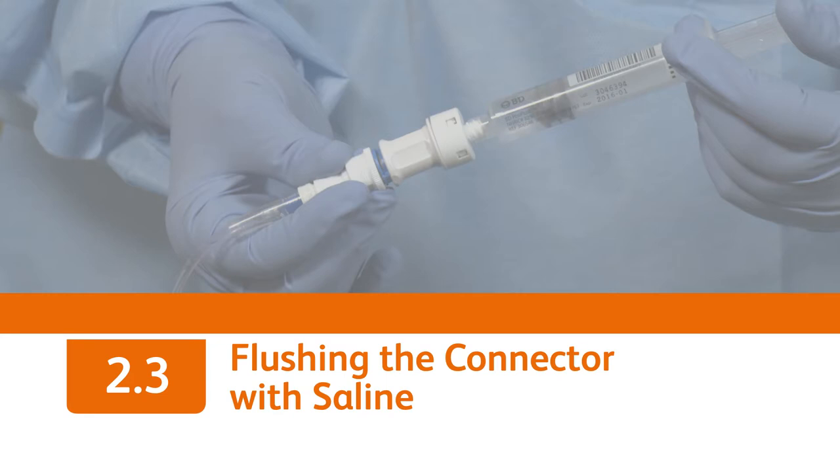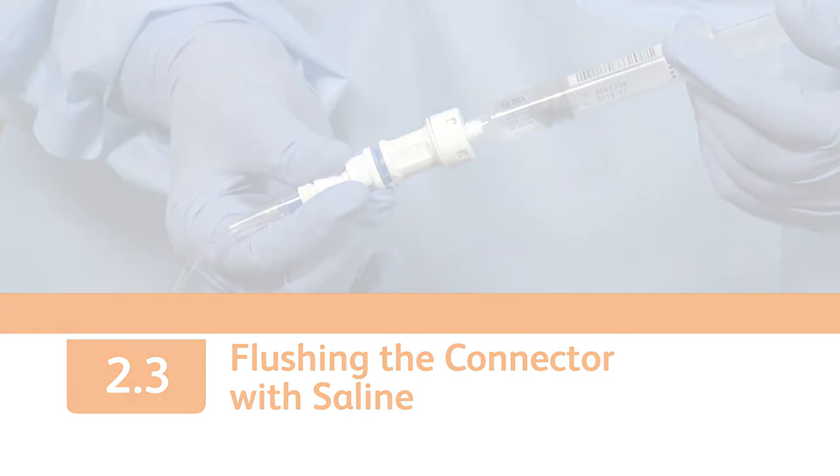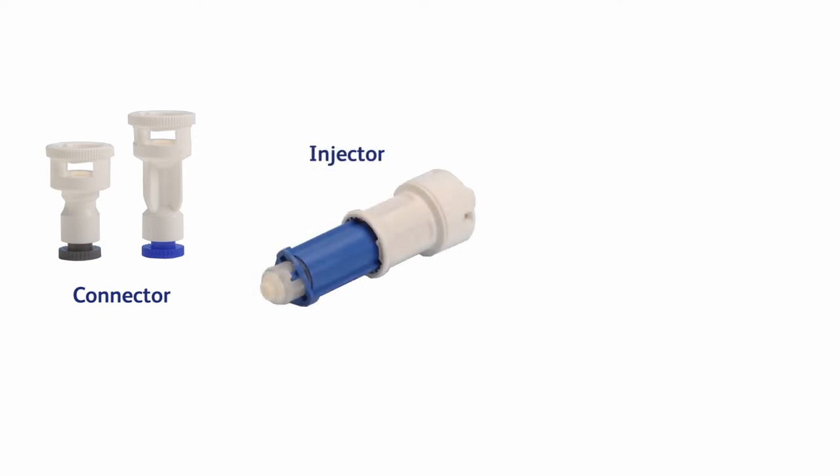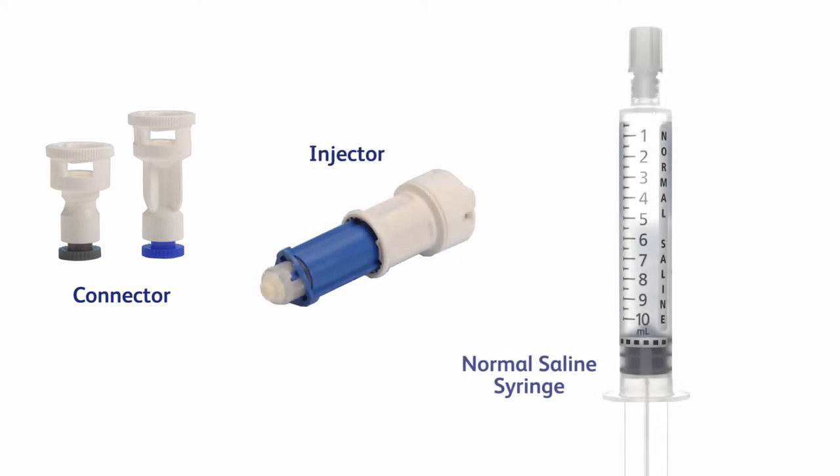Flushing a port can be easily accomplished with the BDFASIL system. You'll need a BDFASIL connector, if not already on the IV line, a BDFASIL injector, and a normal saline syringe, according to your facility's protocol.